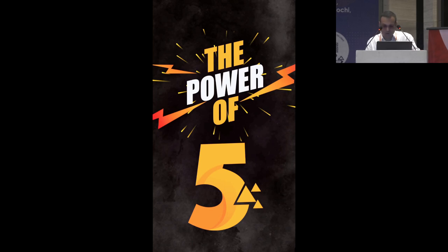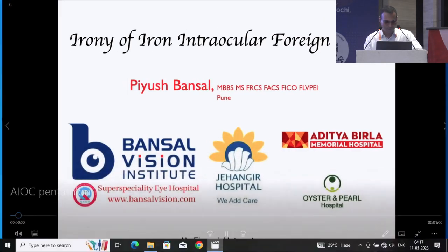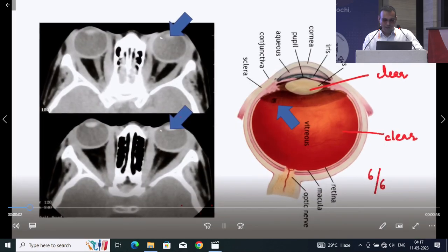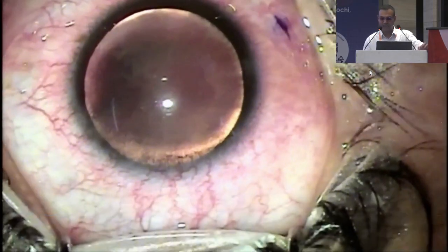So I'm looking for my video, sir. Last time I had shown a video where it was an intraocular foreign body. Let's do a different approach this time. You see that the foreign body is localized in the pars plana and on indentation as well. So we marked it.